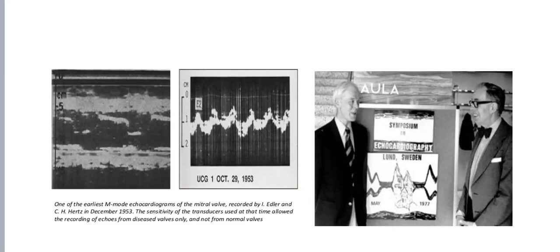Given the entire technology in echo we have now, M mode still offers humble information, but not as good as 2D and 3D and Dopplers and stuff like that. But back then, that's everything they had in echo. It was just the M mode, and then things got going.